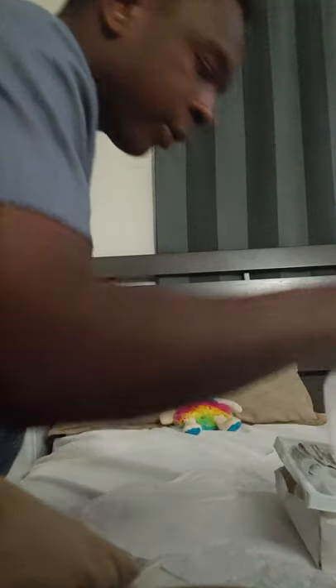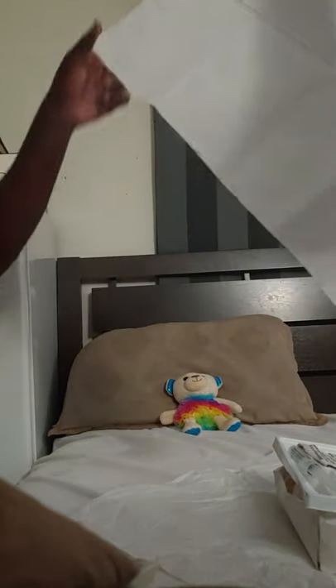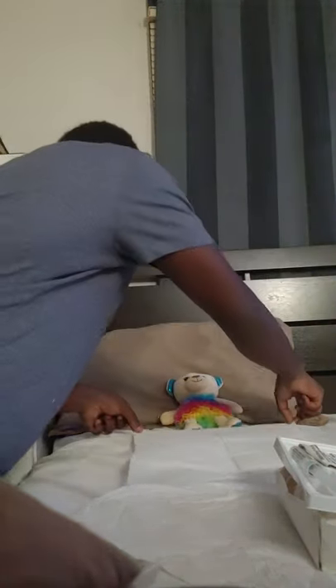Now I have my sterile gloves — I'll put those to the side and put them on in a minute. First I need to put my drape. Grab your drape out at the edges, fold over your drape, always grab the corners, shiny side down, underneath your patient — it's all sterile.